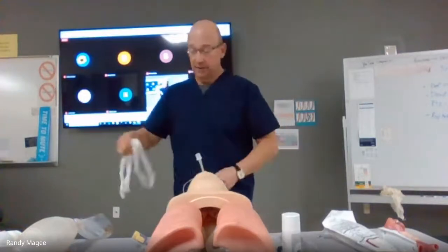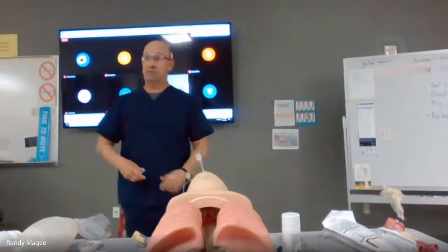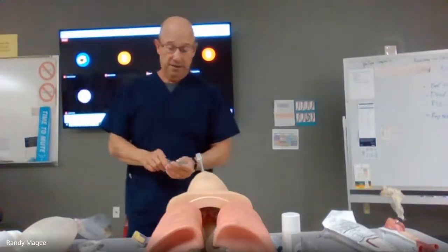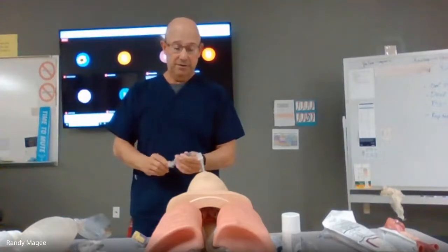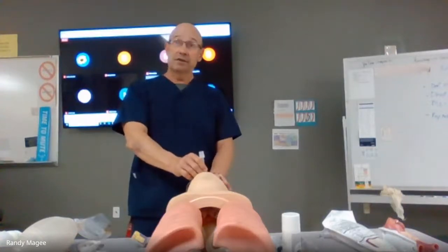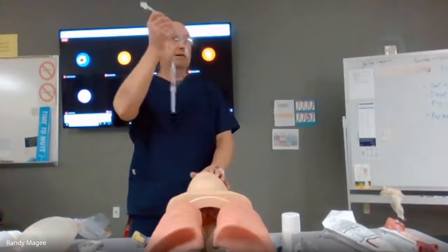Okay. Now, extubation, pull it out, right? Let's say it's time for the patient. Patient's recovered. We want to pull the tube out. So I'm going to take the air out of the cuff here. This patient is conscious, so I'm going to tell him to cough, have my suction ready, and as they cough, pull the tube out.